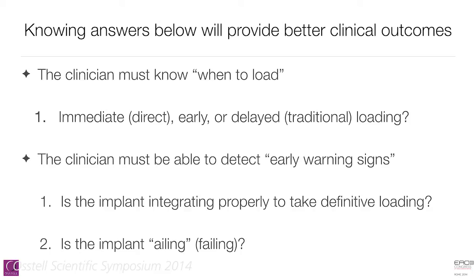We need to know whether that implant is solid enough, stable enough to provide immediate loading, or is it stable enough that we can perhaps go with earlier loading, or must that implant wait a specific period of time, or what we call traditional loading. We also have to be able to detect when an implant is having troubles, when the implant is not integrating at the proper rate, or at this point, if it has integrated at all.